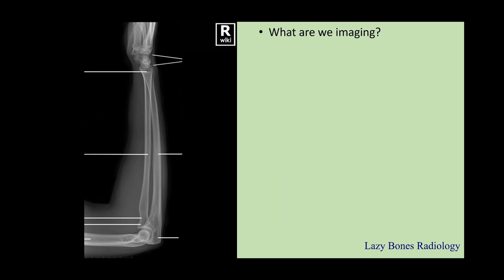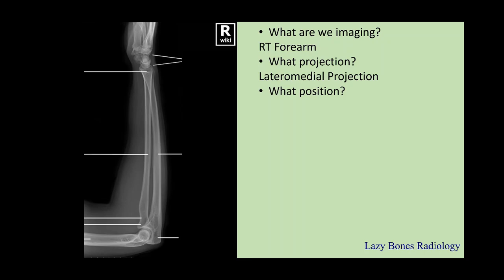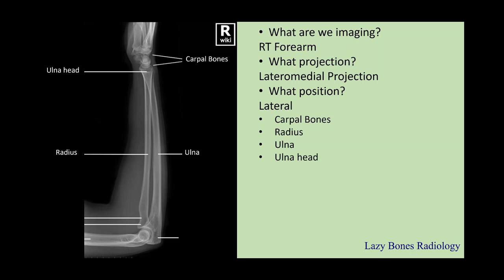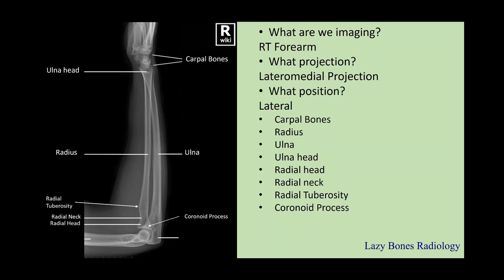Now let's practice. What are we imaging? This is the right forearm. What is the projection? Lateral medial projection. What is the position? Lateral. Now let's practice some anatomy. These are your carpal bones, superimposed. The radius, which is located on the lateral side. Next is the ulna, which is on the medial side. The ulnar head. Next is the radial head, neck, and the tuberosity. Coronoid process. Olecranon process. And the distal humerus.